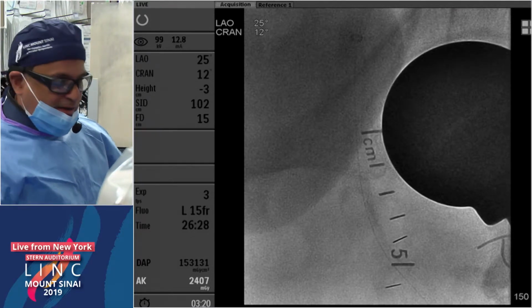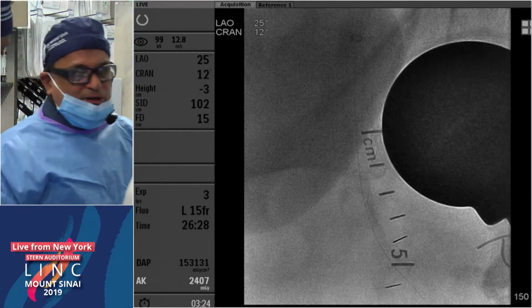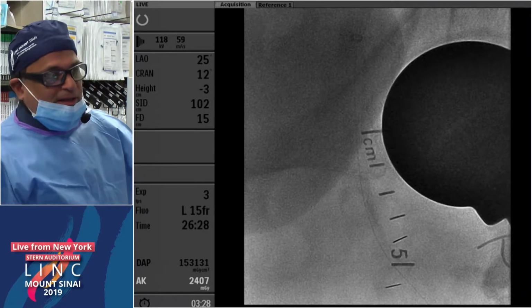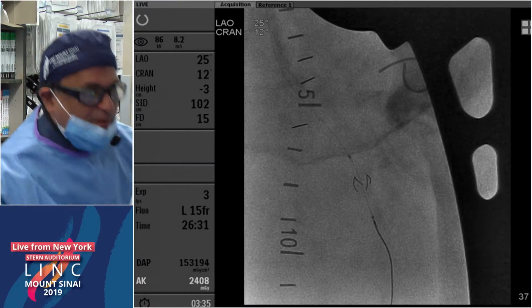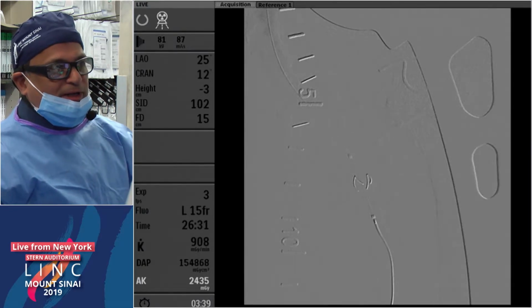And right here, since we're not really concerned about our claudication, let's get the filter. We really just wanted to get her out of rest pain. I think, Peter, it's a great point. But if we were planning on doing a cut down, then we would be treating her claudication rather than her rest pain. So I think here we were able to get a good result.